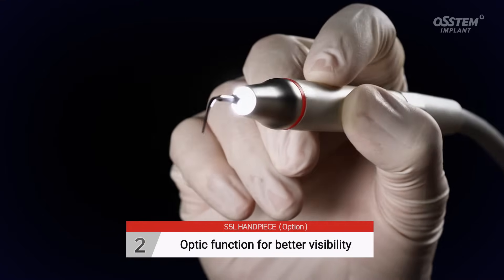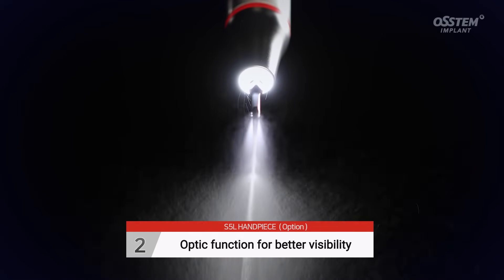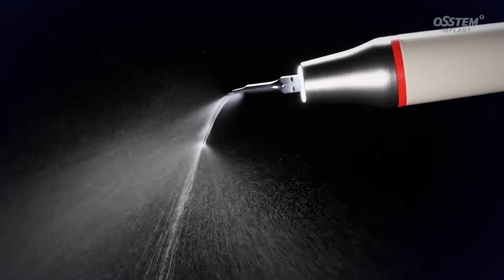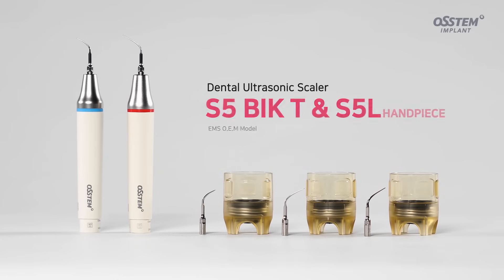Scaling with the S5L Scalar is easy since it has LED light for better visibility. Experience gentle and easy scaling with the premium Swiss Scalar S5T and S5L.